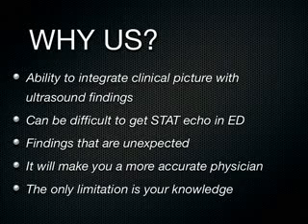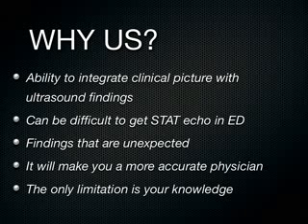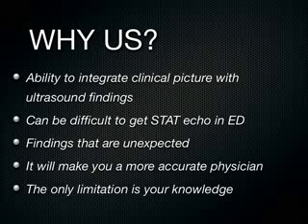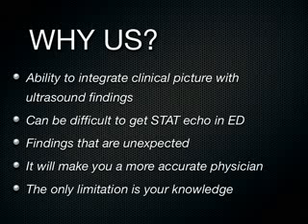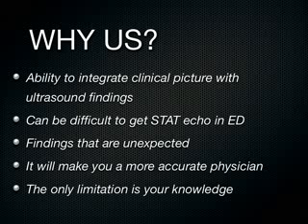We had a case of this just recently, was this two days ago? A patient who came in with fatigue. I just reviewed it today during QA. The students were looking at the gallbladder and other structures, and there's a great ultrasound image of them looking at the gallbladder, but off in the distance towards the bottom of the screen, you can see a big fluid collection with the heart beating in it. Then they focused on the heart, and this was pericardial tamponade, and the patient went to the cath lab and had a pericardiocentesis done as a cure for their fatigue.